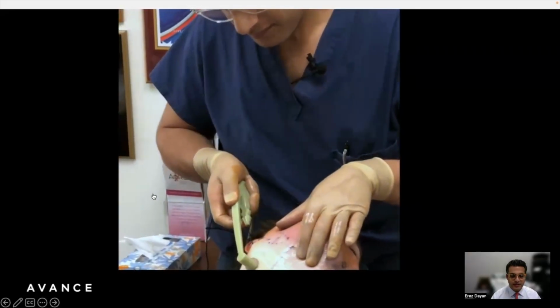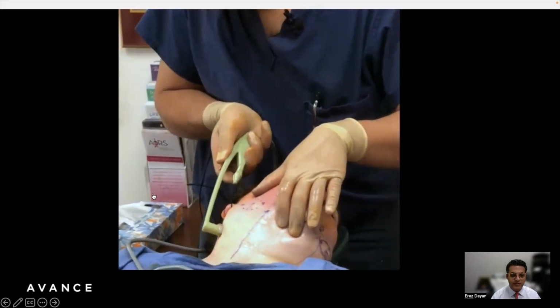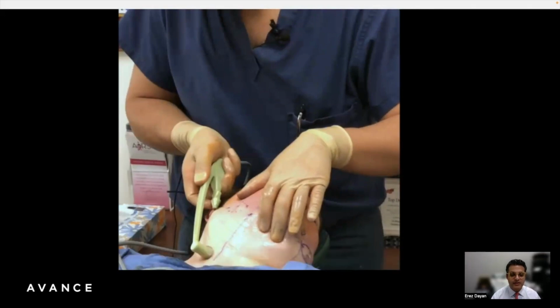So here you can see a treatment. This is typically done before liposuction. And the reason it's done before is a fewfold. First, we have maximal tumescent in the tissue, which is acting as a heat sink. So the heat is not spreading too much. It also helps conduct the radiofrequency energy.